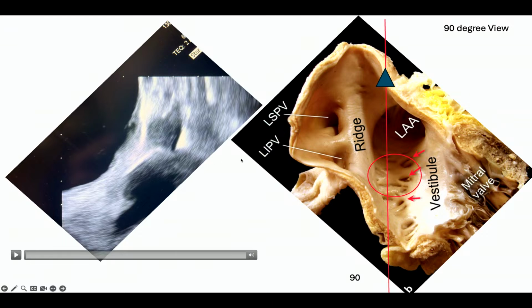This is one view, and you can see we're right there because in this view, we're not seeing any veins, we're not seeing any mitral isthmus, so we're cutting it from the roof to the bottom, okay? You see a little bit of mitral isthmus, but your patient is moving and the heart is beating, but the idea is to have that cut. And if you don't have any shoulder in this view, that's a good implant, okay?